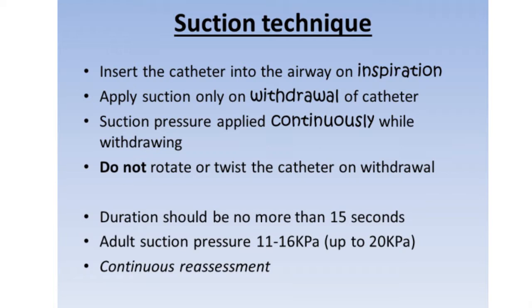So it's continuous reassessment during the procedure. There's no definite recommendation about the number of suctions per treatment episode. It is based on clinical need. Time should be allowed between each suction in order to optimise oxygen levels, assess the patient's respiratory symptoms and any hazardous effects, and reassess as per pre-suction baseline observations.